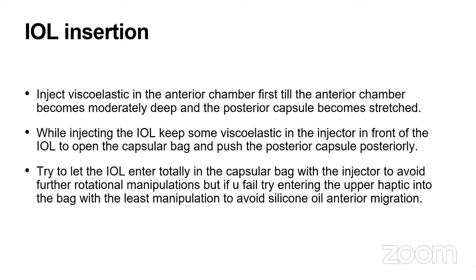You should try as much as possible to let the IOL enter totally in the capsular bag with the injector to avoid further rotational manipulation. But if you fail, you should try entering the upper haptic into the bag with the least manipulation to avoid silicone oil anterior migration.